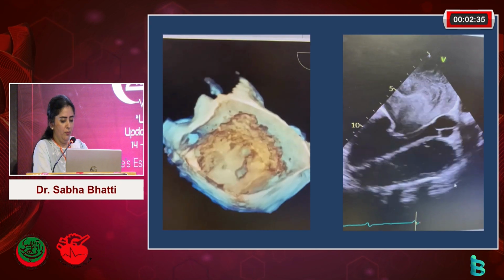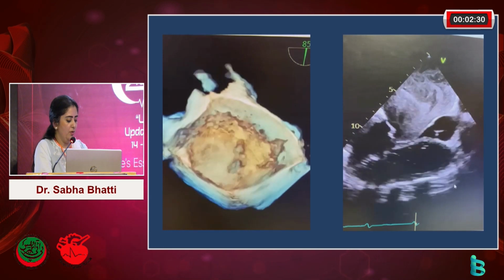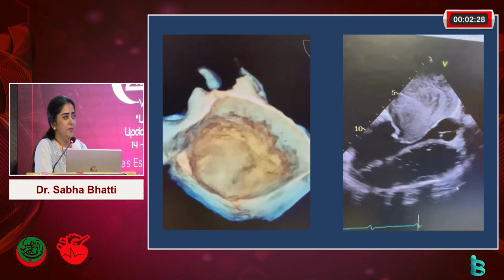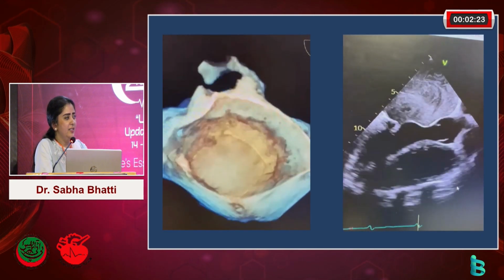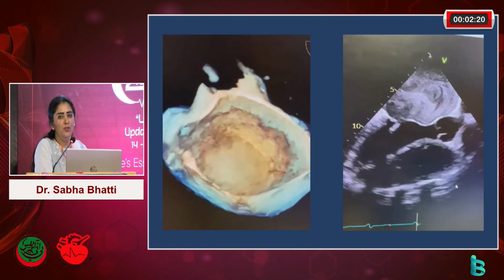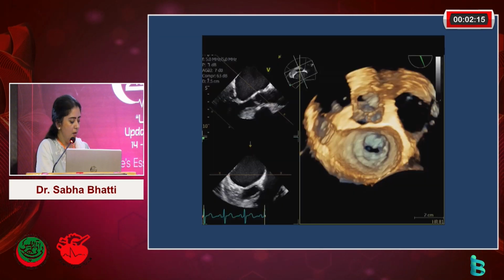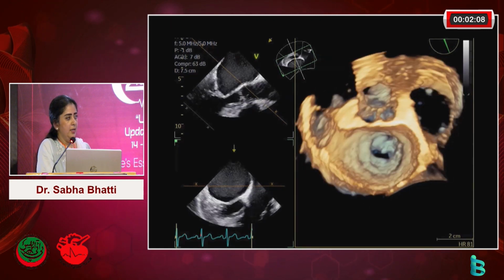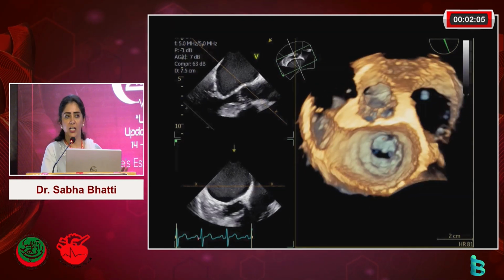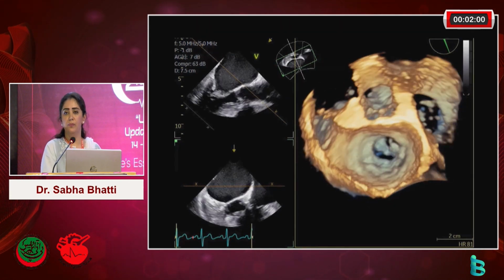Here you see a case of what we see very commonly in Pakistan, critical mitral stenosis. Look at all that smoke in the left atrium. Huge atrium. This patient was around 28 or 29 years old. And this is the patient's smoke and turbulence that looks like a tornado that's captured on the patient's 3D images. And then this is again the patient's en-face view of mitral stenosis. And this kind of measurement that is performed from the atrial aspect or the ventricular aspect is a more accurate way of measuring the patient's mitral valve area.